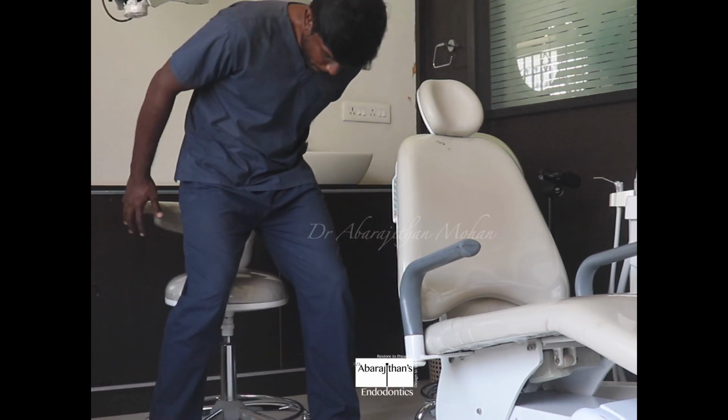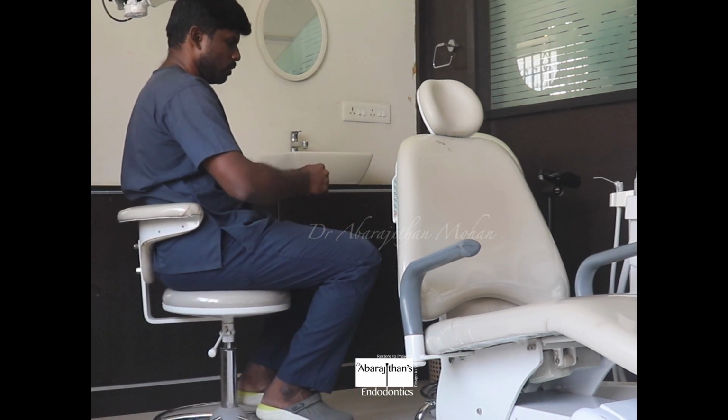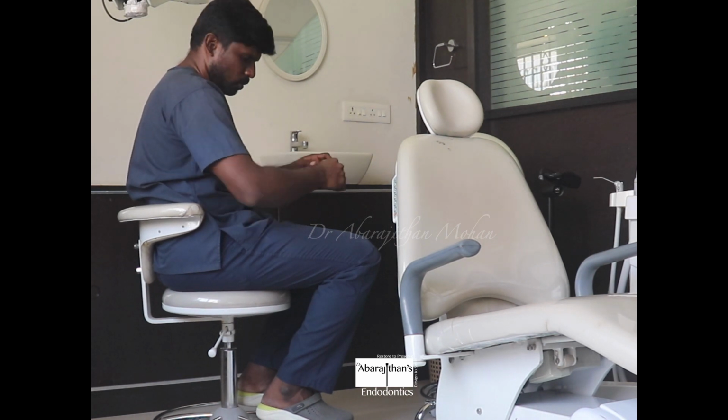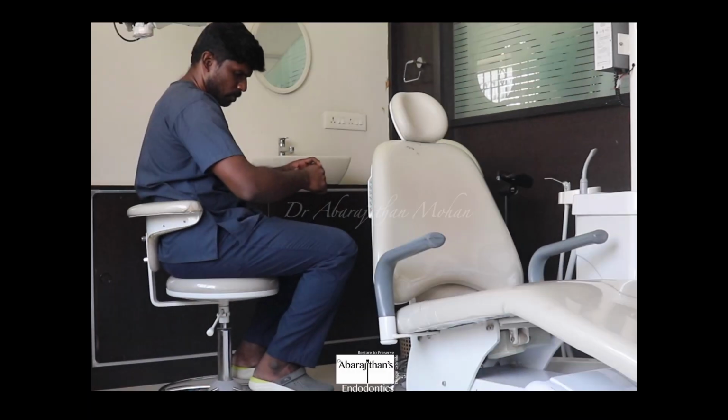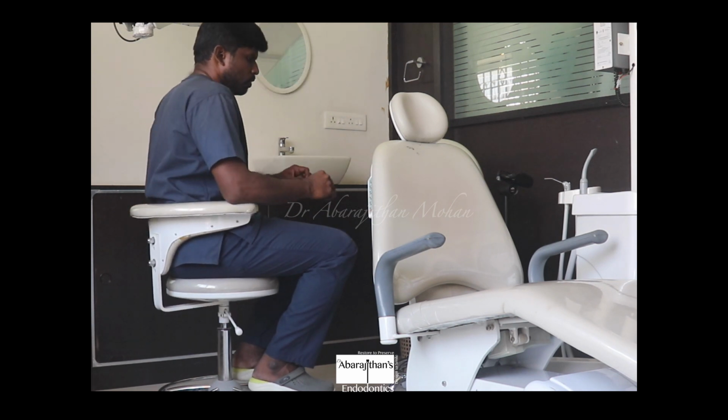But the problem with this dental stool is, you can see here, I don't have an armrest where I can rest my elbow. So to restrict my movements to class 1 and class 2, it's very important for me to rest my elbow. The only way with this kind of chair, if you have already purchased this, is to slightly tilt or move the backrest towards the front and rest one of your elbows, but still the other elbow is unrested here.